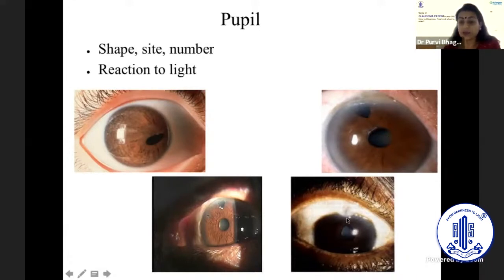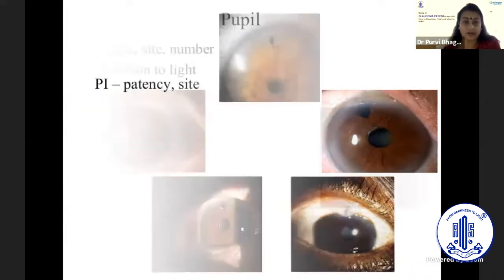And sometimes, the PI is not visible and the pupil is slightly updrawn towards the site of the filtration window. So this suggests that probably the window is getting closed or is already closed with that iris tissue, that you can see peaking there. So again, here you need to do a UBM, OCT, and of course a gonioscopy and see whether this needs intervention or not.